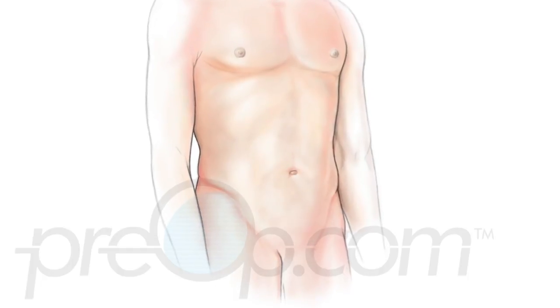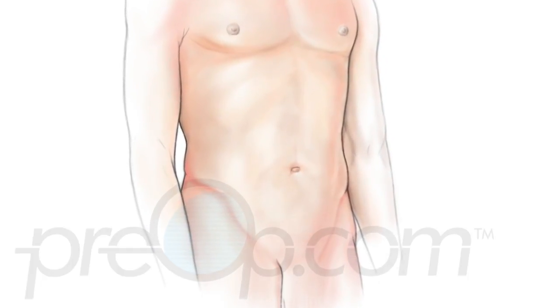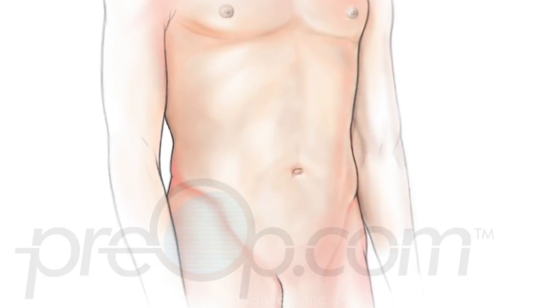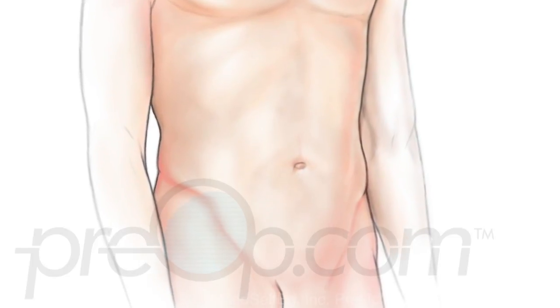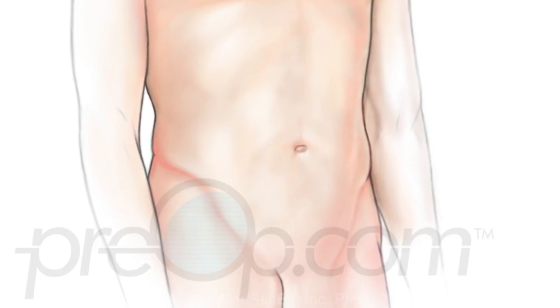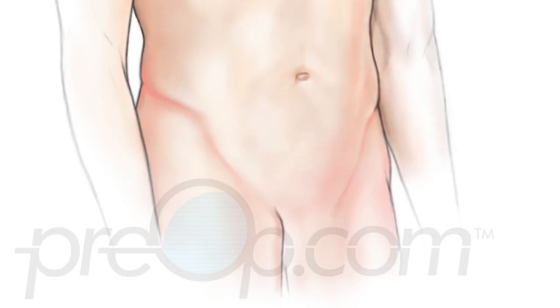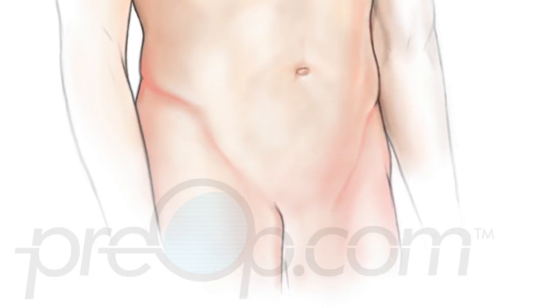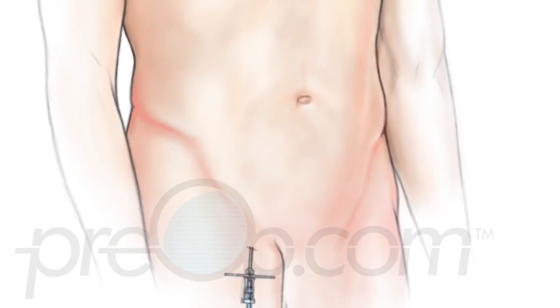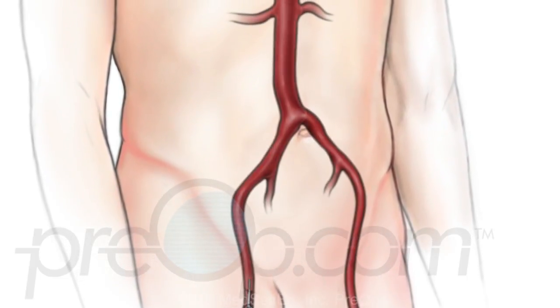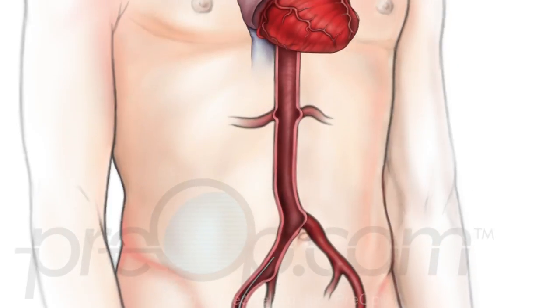For your cardiac catheterization procedure, you will be positioned carefully on an x-ray table. The skin over an artery of your leg or arm is cleaned, then numbed with local anesthetic. You will feel a sting and burn that lasts only a few seconds. A tiny cut is made over the artery and a guide for the catheter is placed. You may feel pressure, but you should not feel pain.